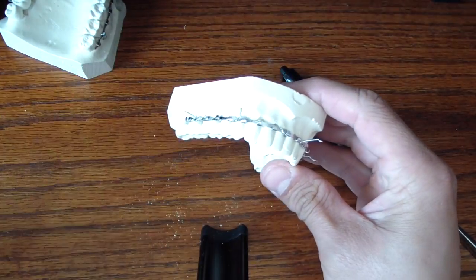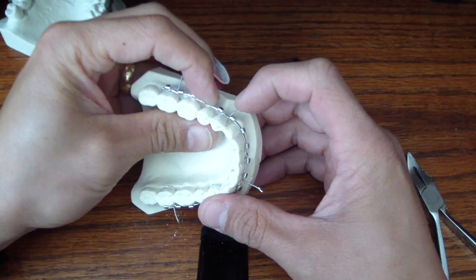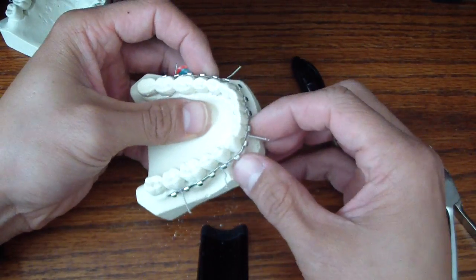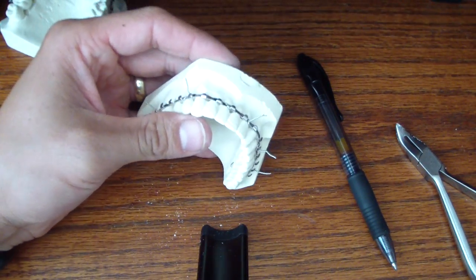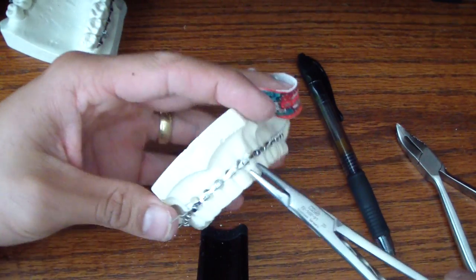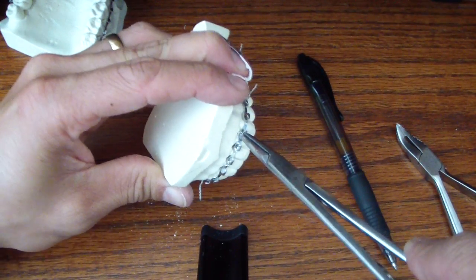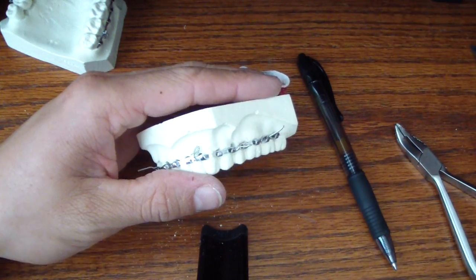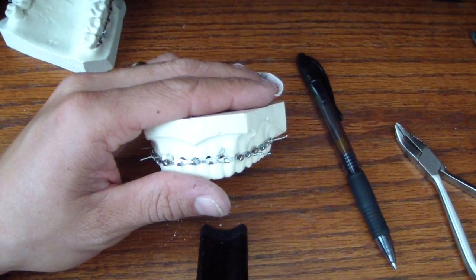Now I have the mandible. I haven't completely finished but I'm running out of wire. Typically would do every second tooth or every tooth, just to make sure that this isn't going to fall off. They're going to have this in for up to six weeks. I've clipped the wires and now we're going to make rosettes. You can use a pickle fork, I've vlogged about that before but I don't have one at home. I'm just going to take this and spin these. We're going to do that to all of them, just make a little rosette so it's not poking and we have some length to the wire if we need to adjust it or when we take these off.